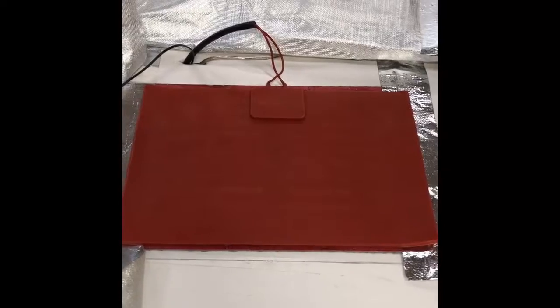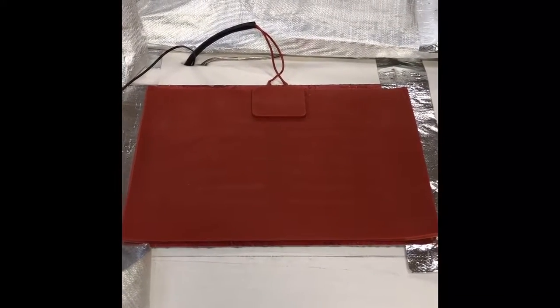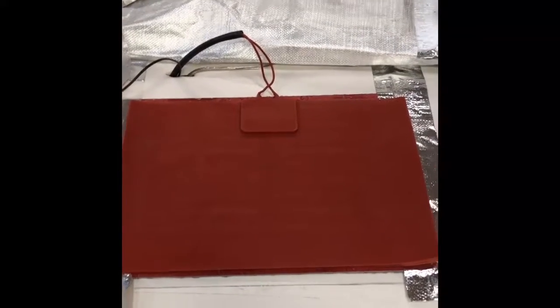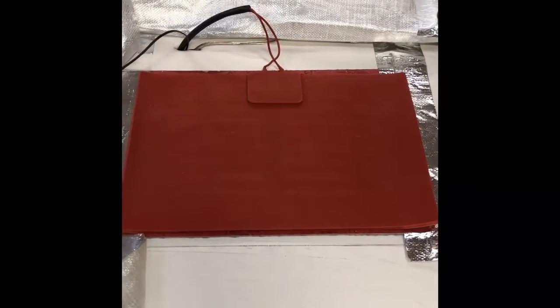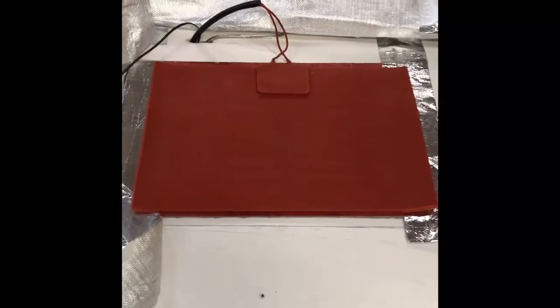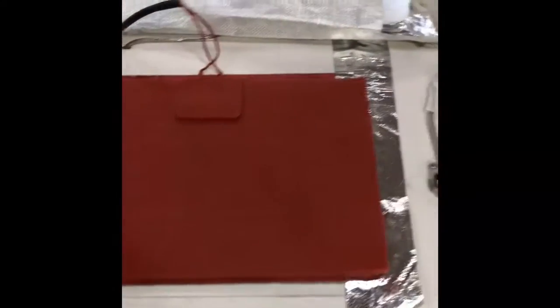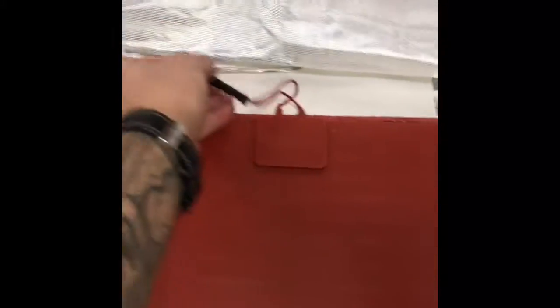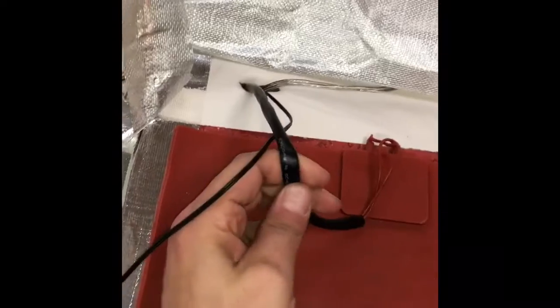Alright, this second video I'll be showing you is if the first video didn't help for the fuse, the second possible cause will be the heating pad on this. What needs to be done, again, we're gonna go ahead and remove this. First, just like the other video, we have to trace this wire down, and this wire goes straight down.